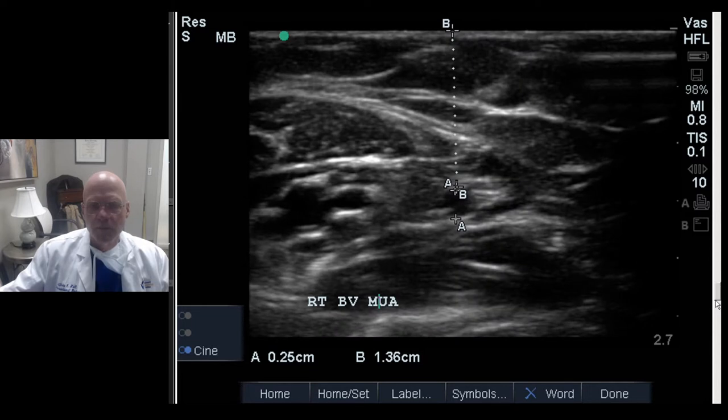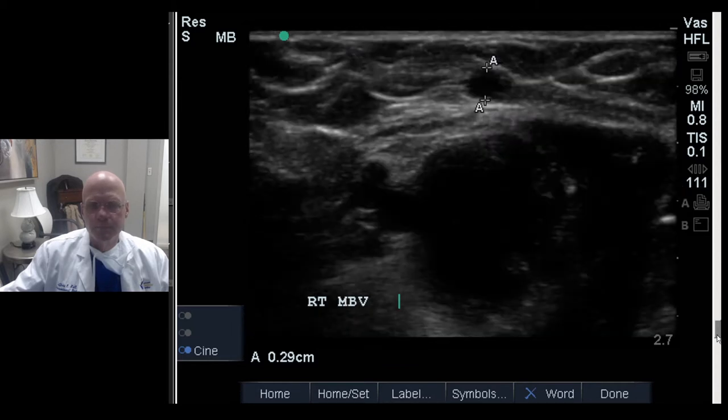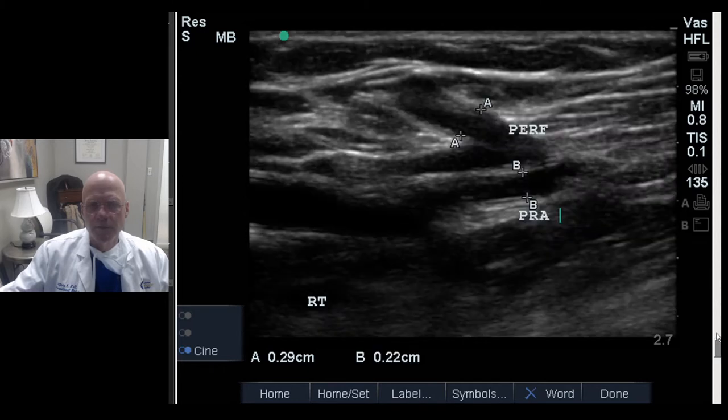Then we have the basilic vein a little higher up. It gets about 2.5 millimeters, so a little bit of concern here, just all the way around. And then as we get more centrally, it gets big again. Here's the median basilic vein, good size, 2.9 millimeters in diameter. And then here's our image of the perforating vein. You can see that it's straight in this segment here as it approaches the proximal radial artery. So this makes this a pretty good candidate.